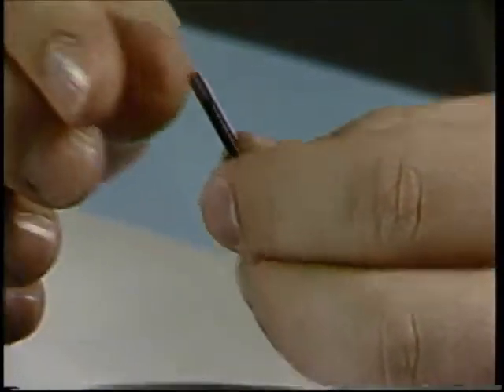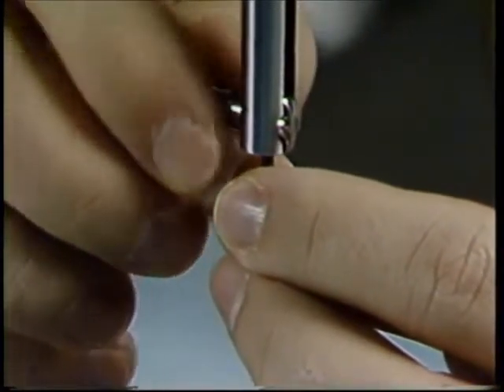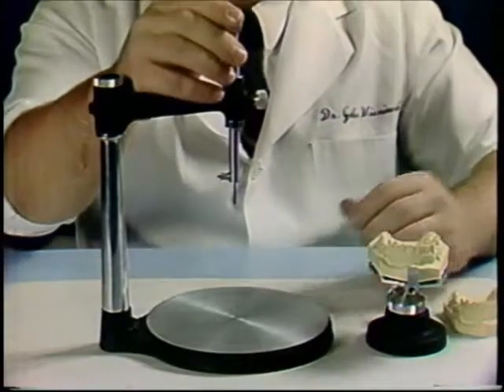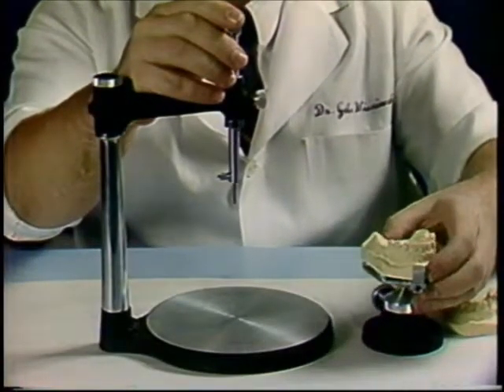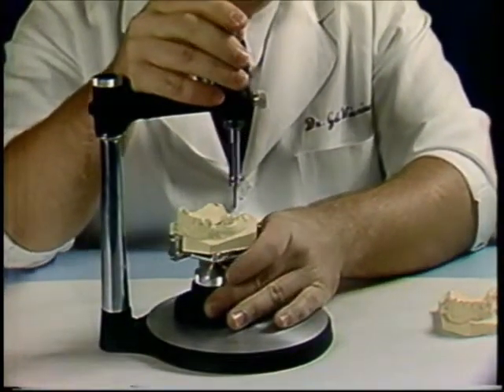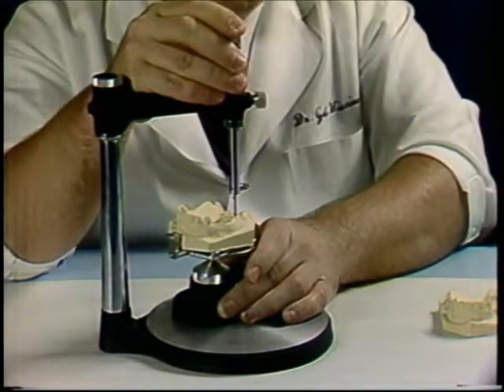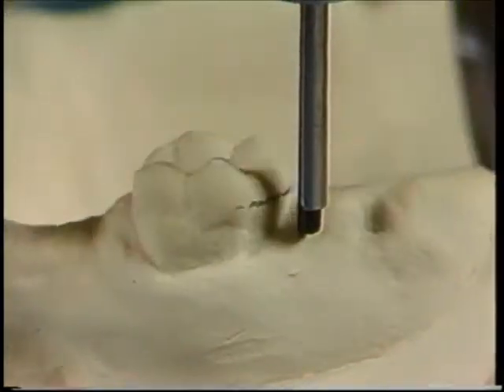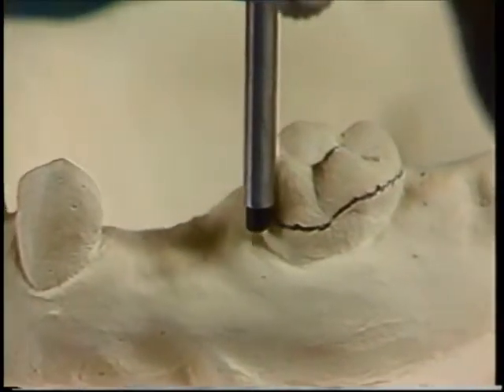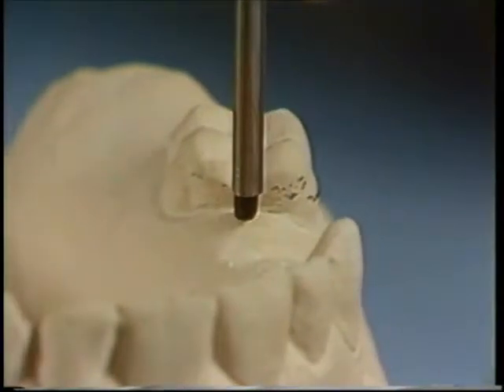Each abutment in turn is examined. Then the carbon marker is placed in the vertical spindle. The carbon marker is used to delineate the height of contour. This line is known as the survey line. The survey line is used to mark the entire circumference of the tooth.